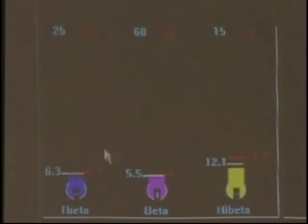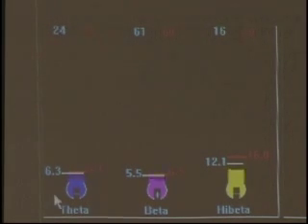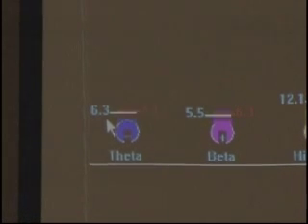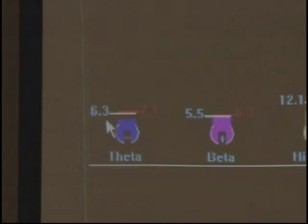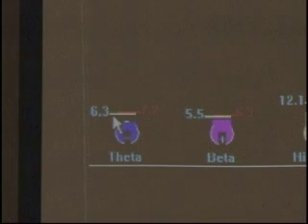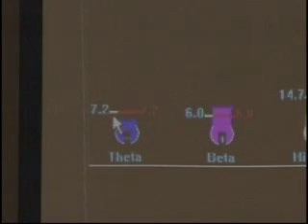Looking at the thermometer — I see 6.3 in blue and it's not fluctuating. That's the fixed threshold that feedback is currently based on. This is what's giving us our points and our sound. So this fixed threshold is what the feedback is based on. Is your blue lower than your red within the inhibitor?